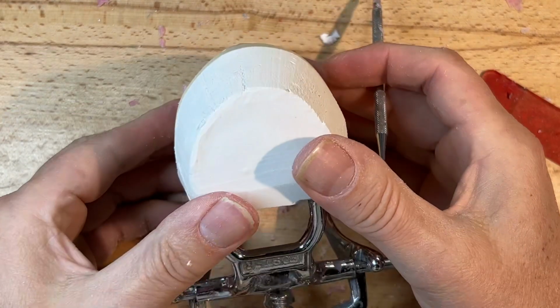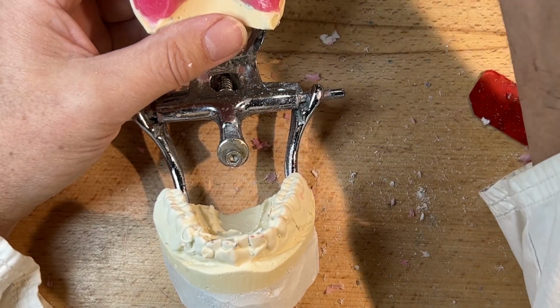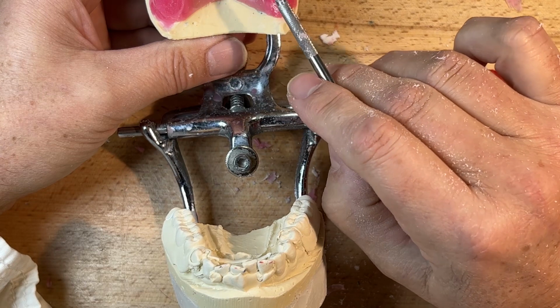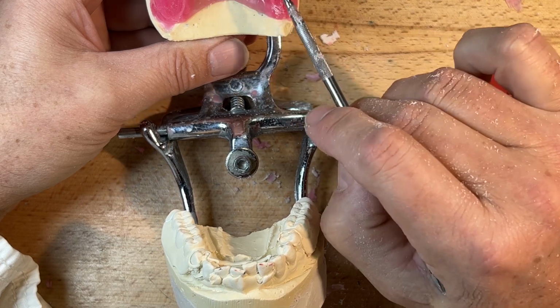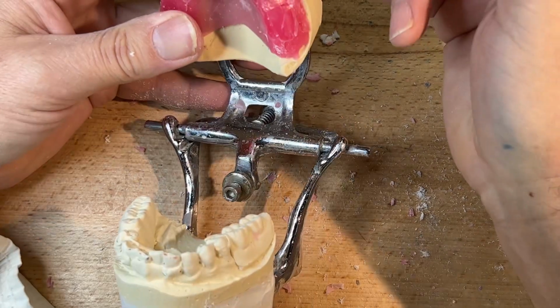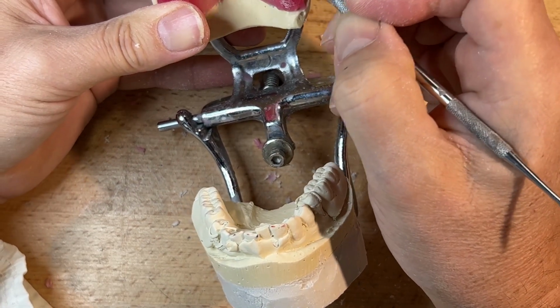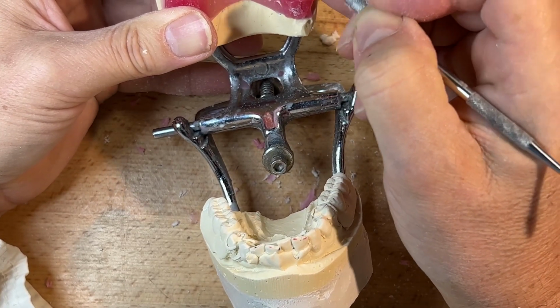If you were to choose to look at this in the mirror, you will have a reverse reflection, which will give you a different perspective. If we are a right eye dominant individual dental technician or left eye, that is a difference in which eye I'm using to locate these teeth. I'm using my right eye, and it's different if you use the left. So you have to be cognizant of these things.